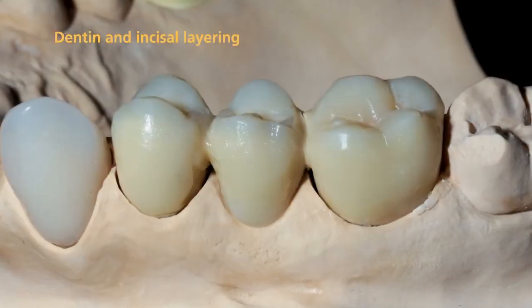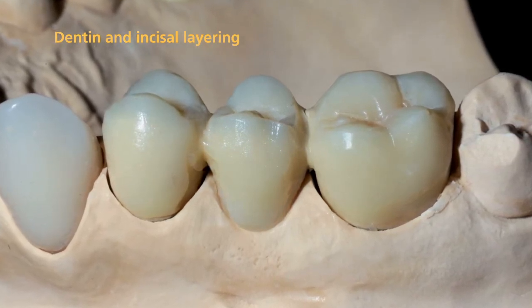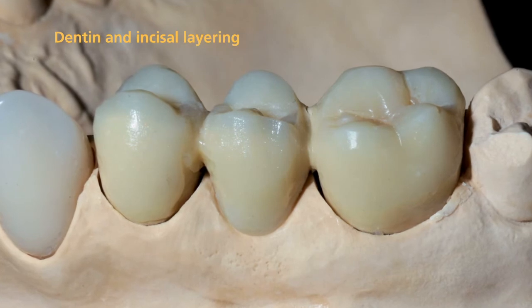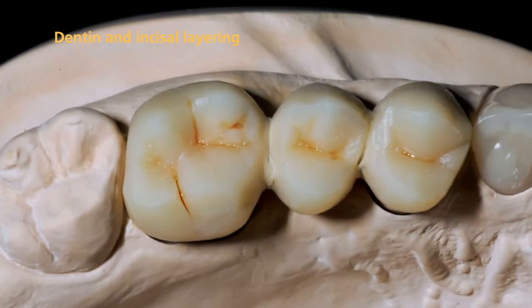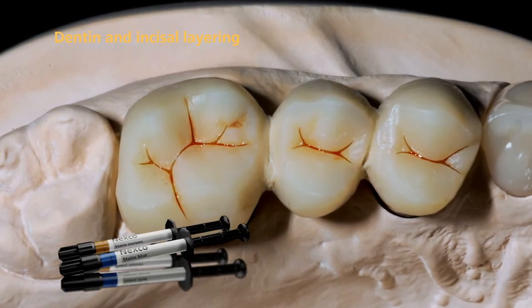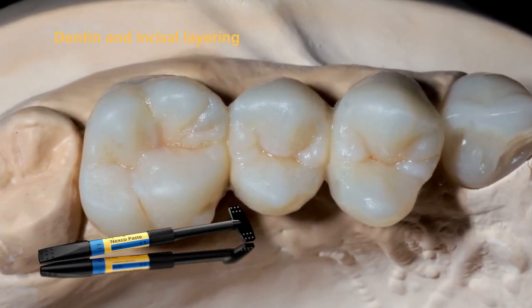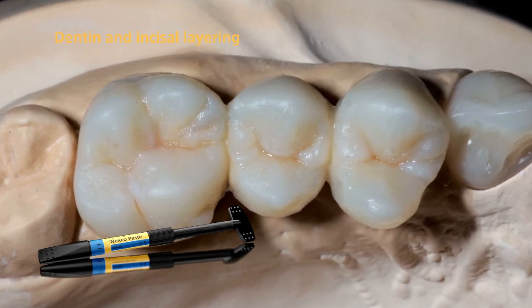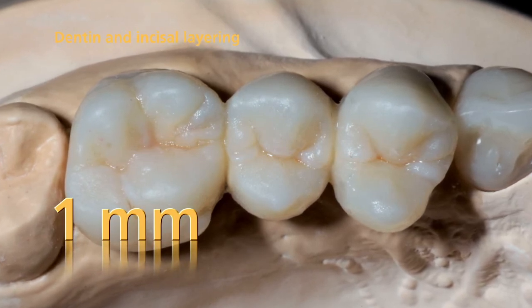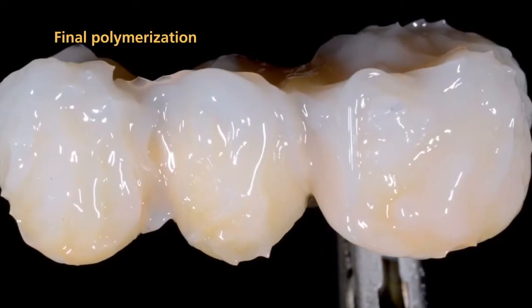Design the dentin body in such a way that the shape of the mamelons is outlined in the dentin. In particular, make sure to save enough space for the subsequent application of the incisal and transpa materials. SR-NEXCO stains may be applied into the fissures if desired. Complete the incisal area step by step using incisal material. Please note that the layer thickness of the veneering material should be 1 mm to achieve an optimum shade reproduction.